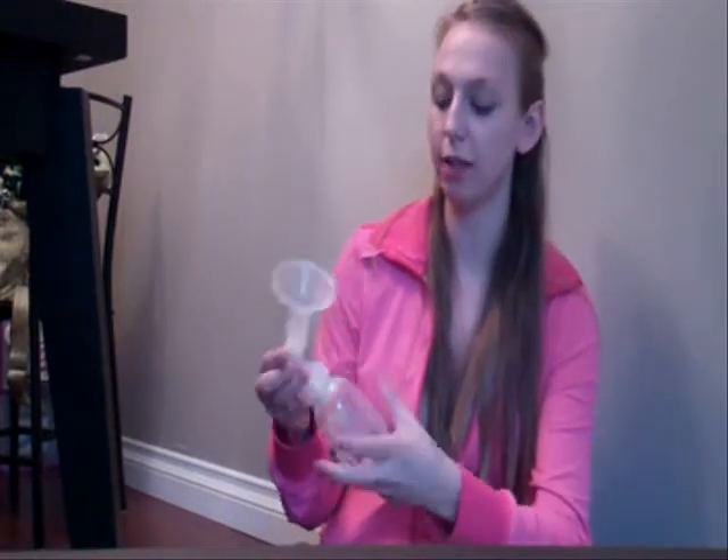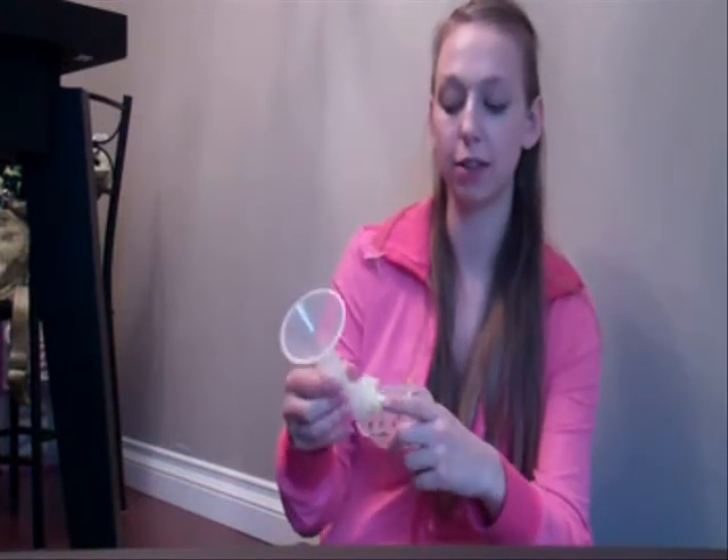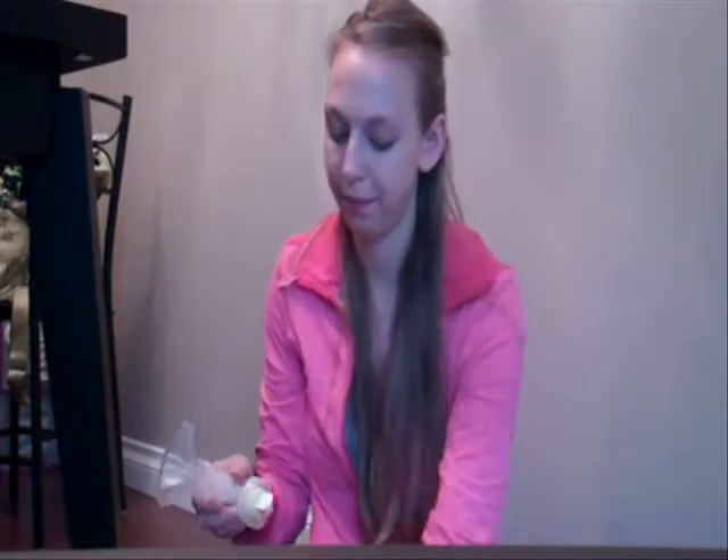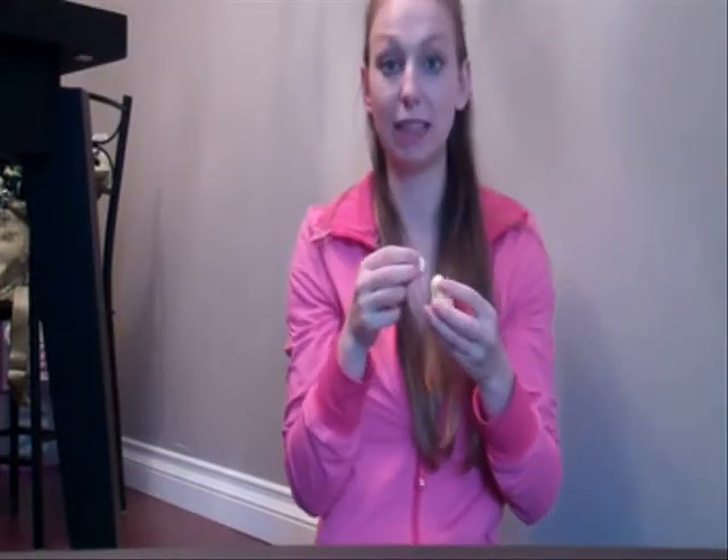Sometimes I have issues getting this little part out. There's a little flap that you have to be really careful to clean right under there. This little piece here is hard to get off after a year of use, but this little flap comes right off. So you have to be careful not to lose that and to remember to clean in there really well.